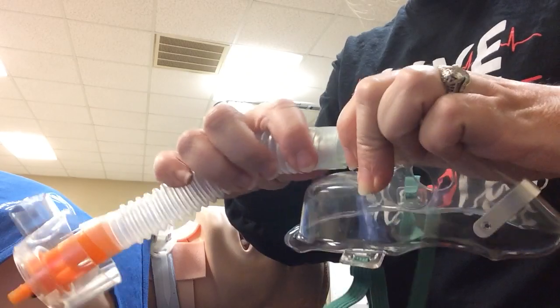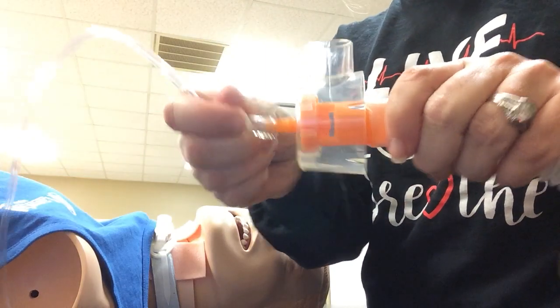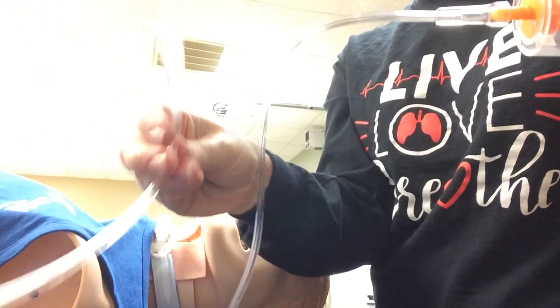Your mask goes there. And then your last part is your oxygen tubing — one part connects here, and the other side goes to the flow meter.